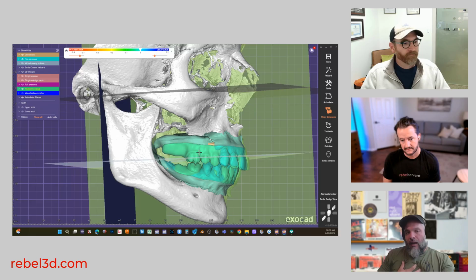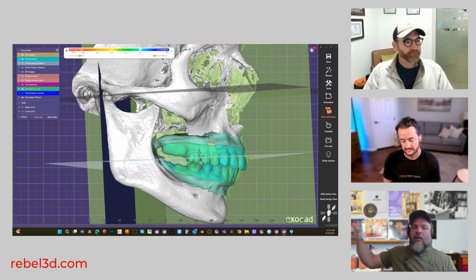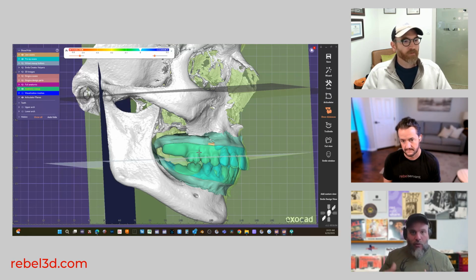And then the ideal situation is I have enough data, number one, and number two, enough instructions for me to get my design as close to your ideal as possible in the first iteration. And if we both are communicating in such a way, then the likelihood of you having to have 3, 4, 6 visits with your patient diminishes. Now you can have a patient go home happy with their finals 2, 3 visits in, and that's it, which would be the goal.